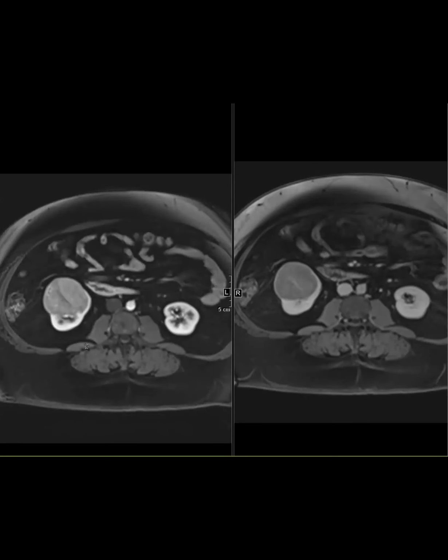I should probably know. I'm sure you'll know it once I say it. When you see that one part of it goes from hyperenhancing to washing out, but then the central scar has delayed enhancement, that's called segmental enhancement inversion. It can be areas where half of the lesion does it, but it can also be where a central part does it.